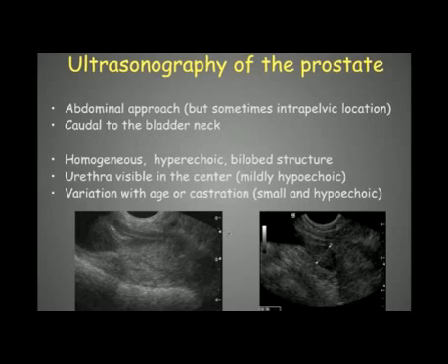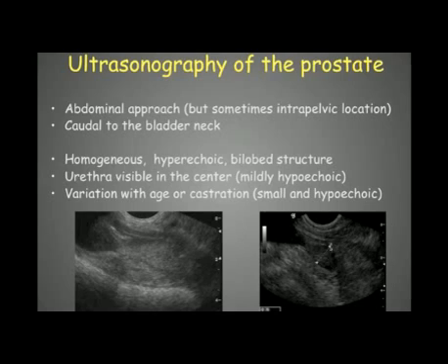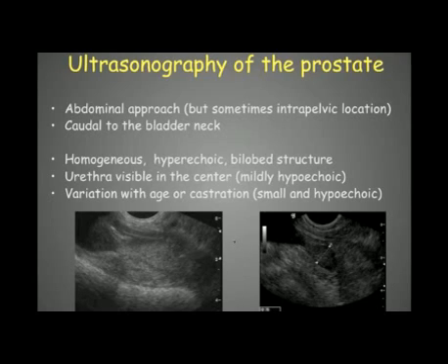There can be some variation of the prostate with age. In an intact non-castrated dog it can become bigger, whereas in a castrated dog the prostate will appear small and hypoechoic — that is the typical image of a prostate in a castrated dog.